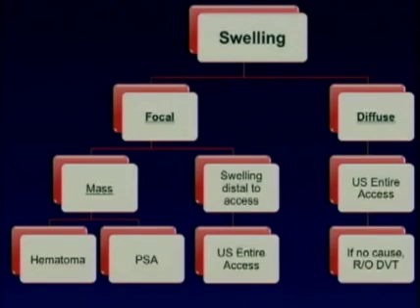So this is a diagram of really what we're looking for with that history, because you really don't know when the patient walks in the ultrasound suite, we know we're going to be looking for swelling, but we don't really know if it's going to be focal or diffuse, because usually our clinical histories are good, but not exactly comprehensive.